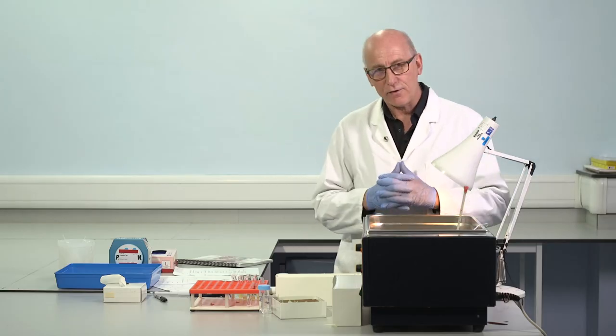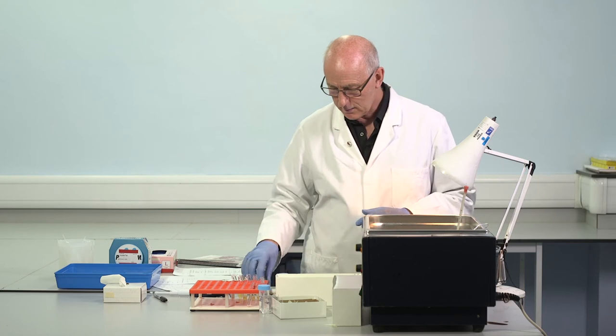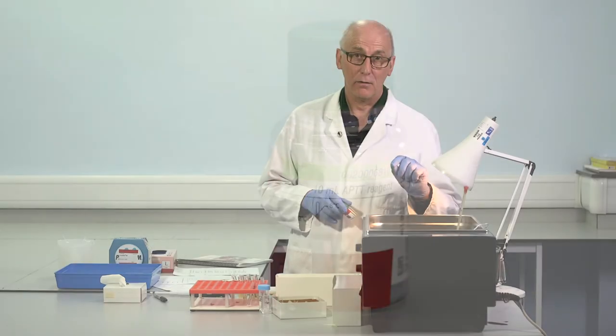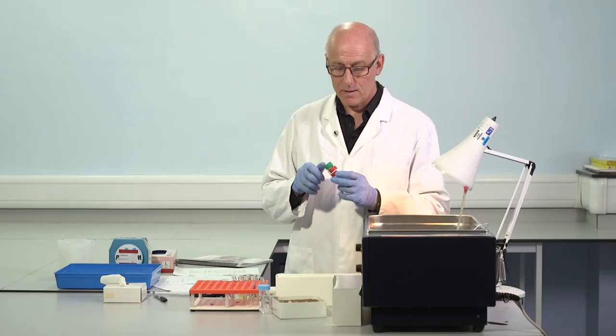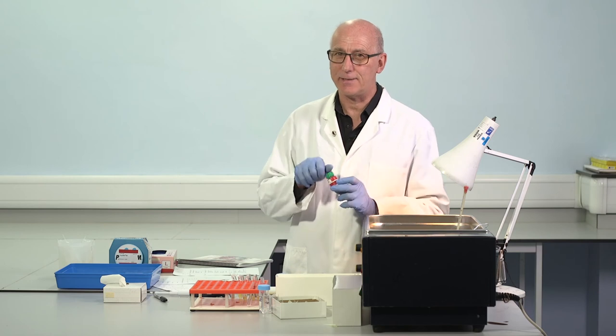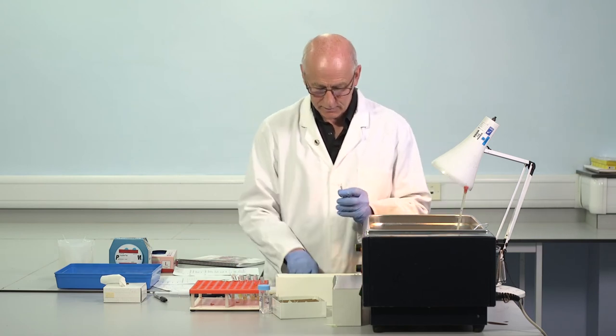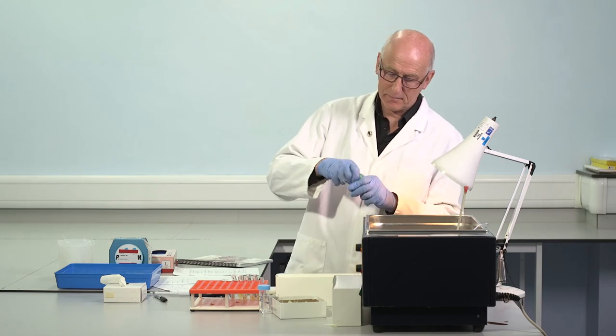So the tests we've performed so far are with one particular APTT reagent. I just want to do a couple of tests, just APTTs, on two of those samples. And I want to repeat that now with the second APTT reagent. So I'm going to put out some of this to be warming.